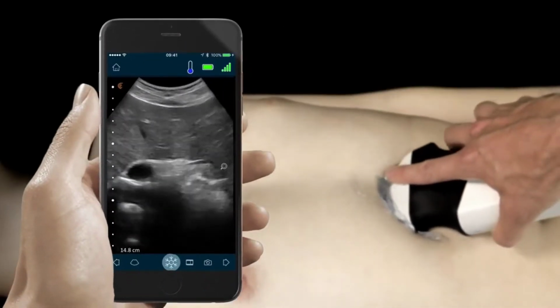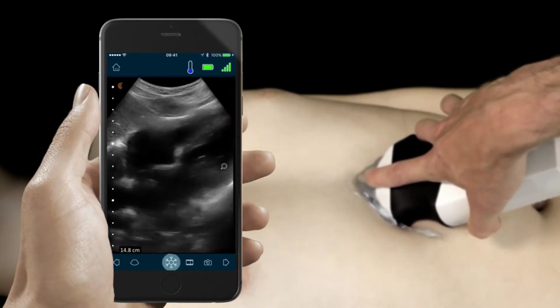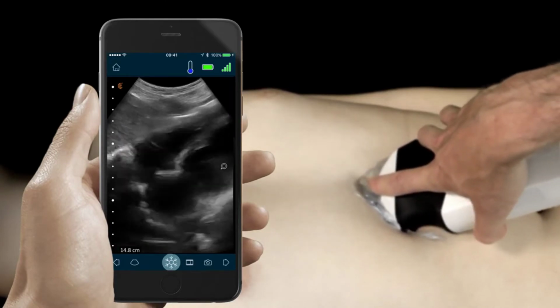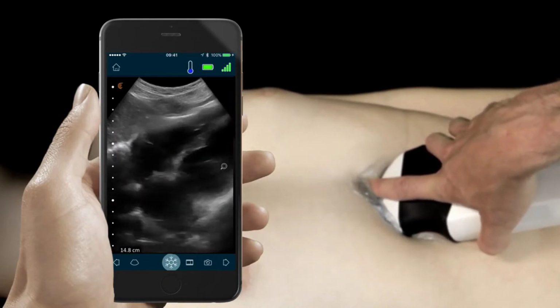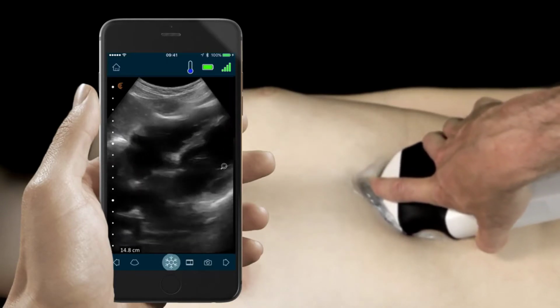The next step will be looking at the heart using the subxiphoid window. We'll be looking for any sign of fluid in the pericardial space. If you're not able to generate adequate views from the subxiphoid area, you can use the Claris clip-on attachment to generate views from the precordial windows.